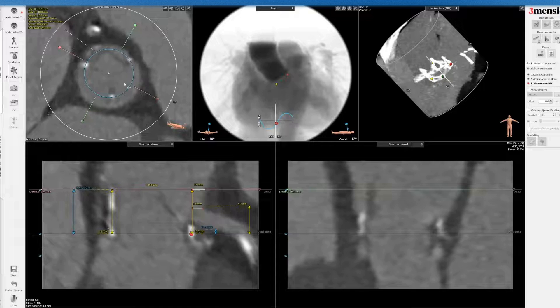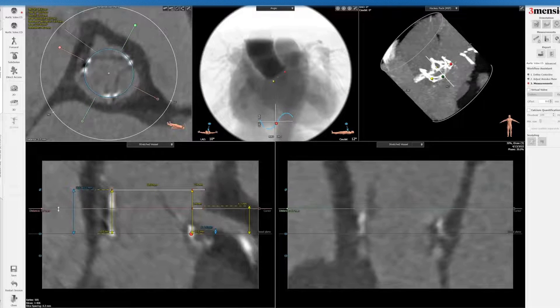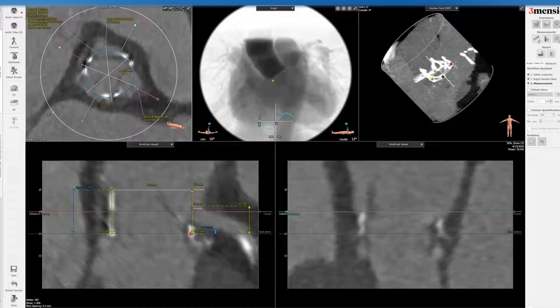When that's done, you can see this is the STJ — I'm going to save that now. I didn't explicitly trace the sinus of Valsalva, but you can see it's very small sinuses. Going from commissural post across, commissural post across, and commissural post across — the sinuses are very effaced, only 22 to 23 millimeters, and 20 millimeters on this view. This patient has a very small sinus. I'll save that.